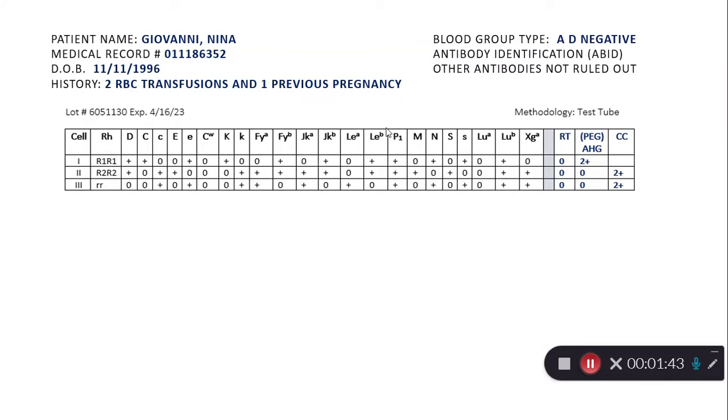So here we have some information about a patient. I've made this up. You'll see that this screening antigram looks a little bit different than you're used to looking at if you've worked in a blood bank for antibody identification and screening, because I make these up myself so that they're accessible to all learners. They have the same information, they're just a little bit different looking in style.